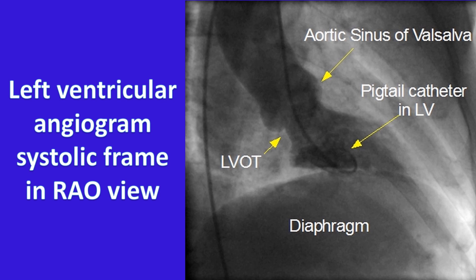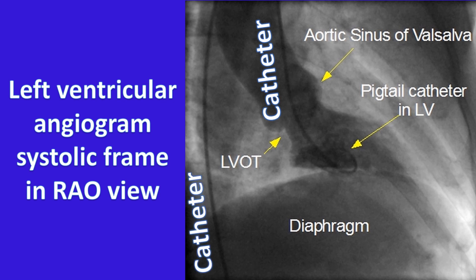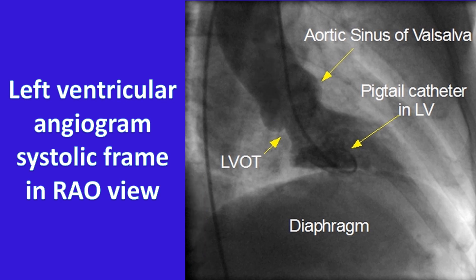The catheter is visible in the ascending aorta and descending aorta, meaning the pigtail catheter was introduced through the transfemoral route. Contrast-filled bulges in the root of the aorta are the aortic sinuses of Valsalva.